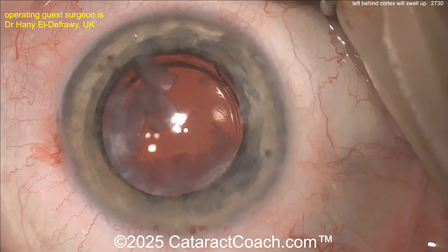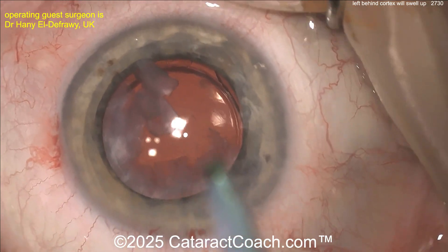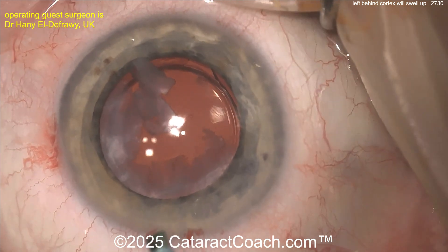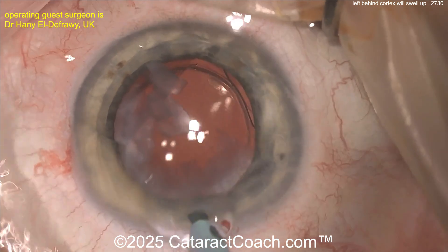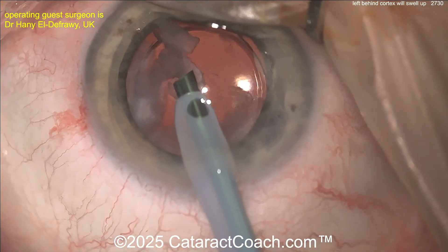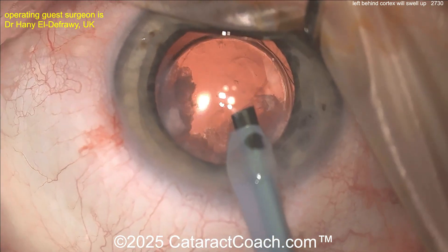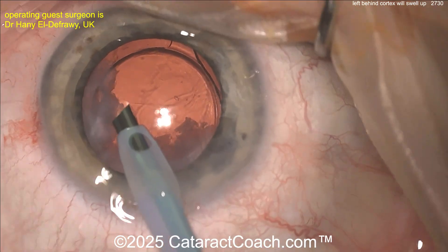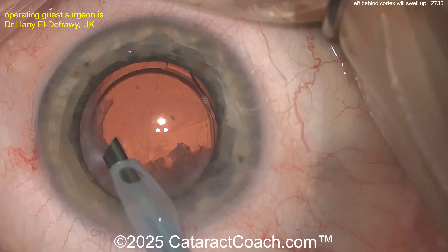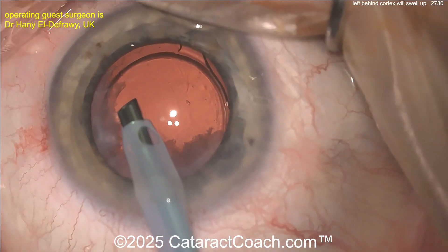So now what do you do? You have to go back in the eye. Our guest surgeon has a patient done elsewhere and you've got to go back inside and use an IA probe to clean all this out. It's much easier to move now than later. You could go in with the phaco probe, but you could probably get the whole thing out with just the IA probe. Here's the phaco probe going inside — it's really lens cortex, look at that, just goes right away. You don't need phaco power here; I would just use bimanual IA.